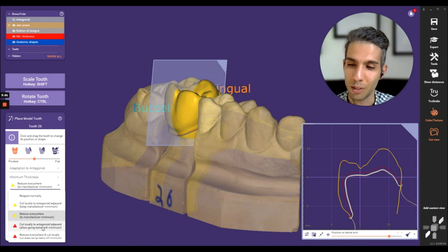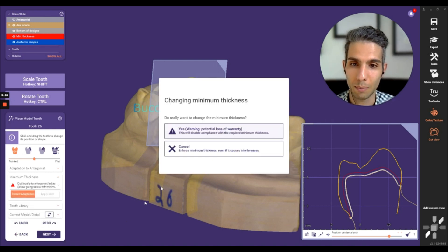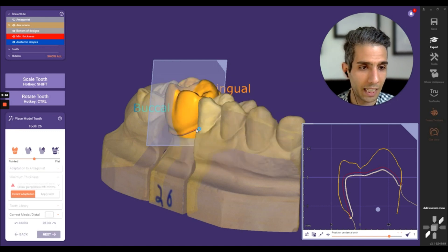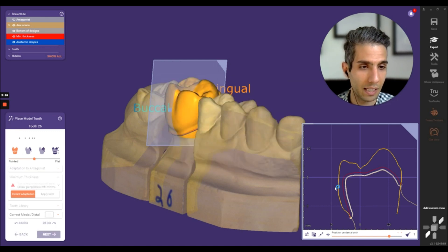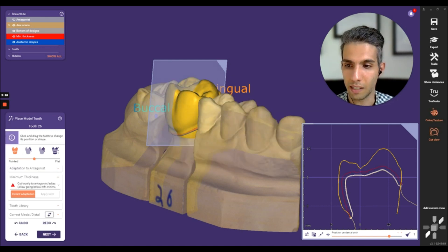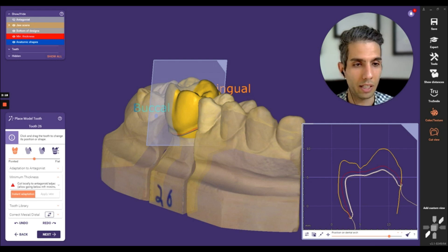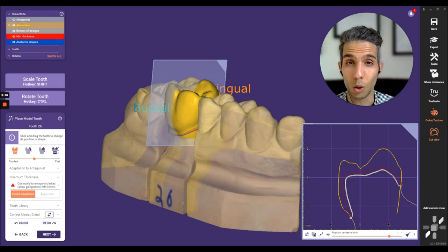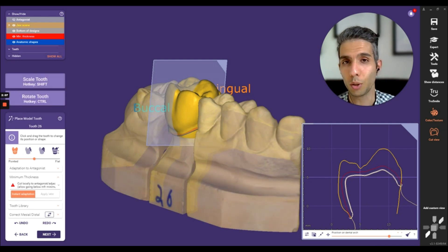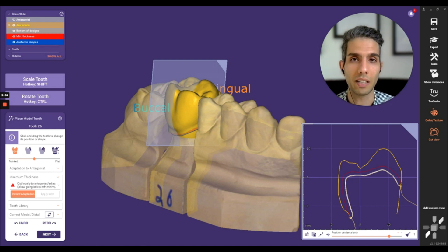By clicking one of them, I will receive a warning. Clicking 'Yes,' I will see that the minimum thickness is cut locally to antagonist and adjacent. I hope you find this video useful — please leave your opinions in the comments and stay tuned.